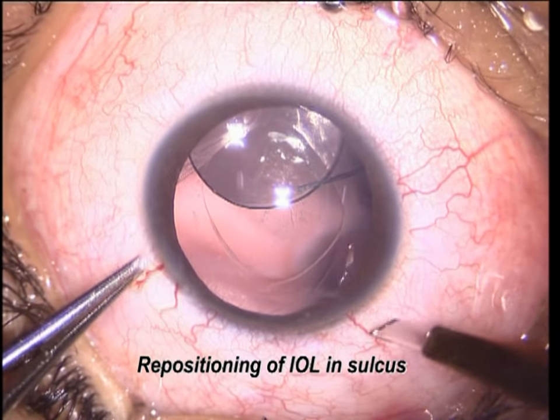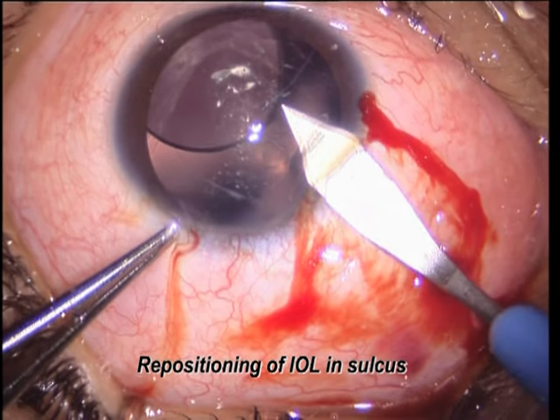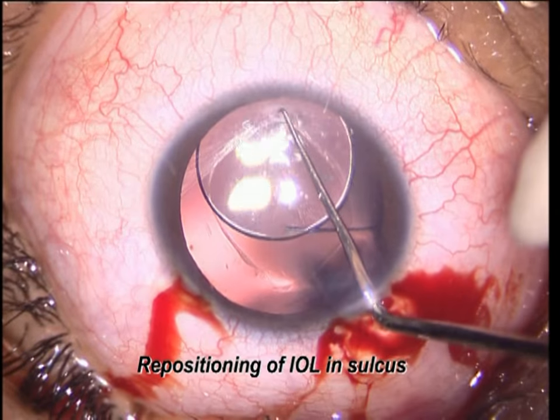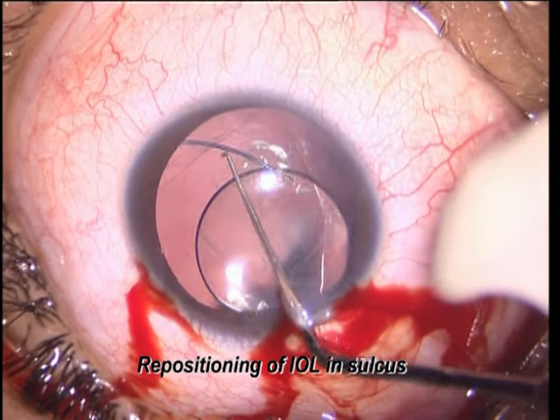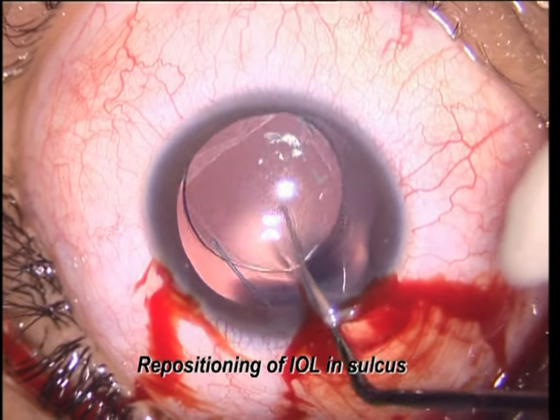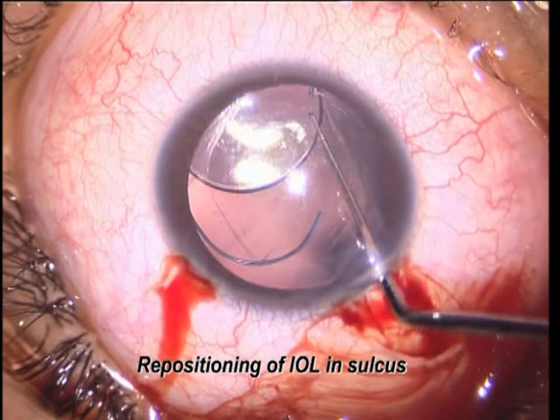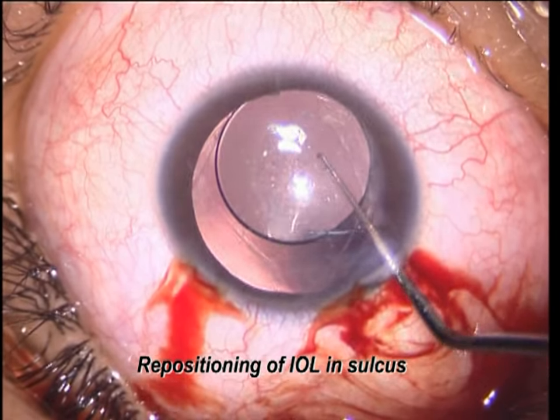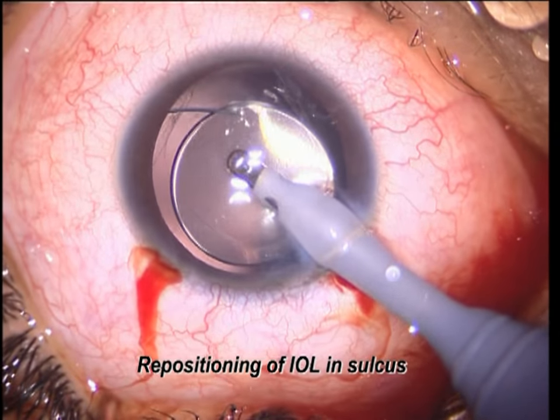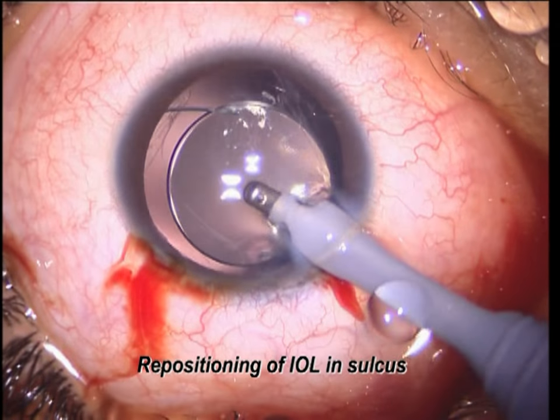This is another case. The 3-piece IOL has decentered into the sulcus, plus there is a posterior capsule rupture, but there is a good rhexis margin, and it can easily be centered with the help of a hook without disturbing the vitreous.